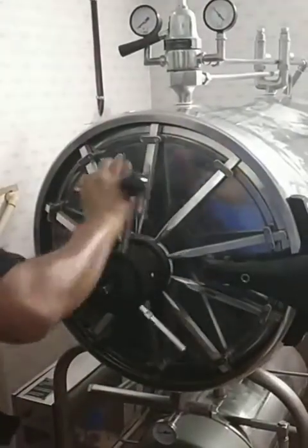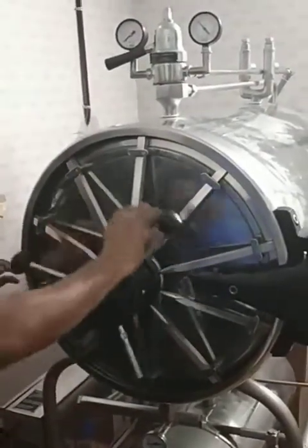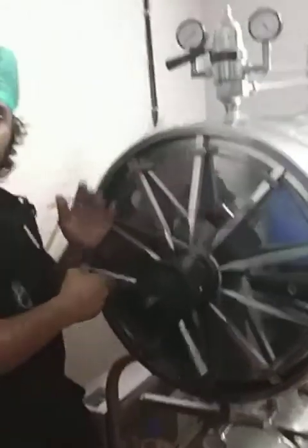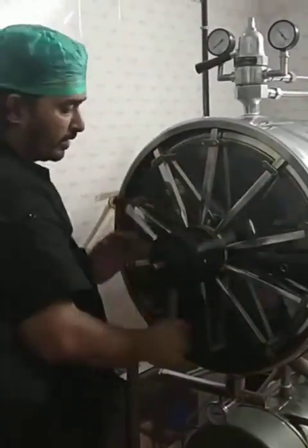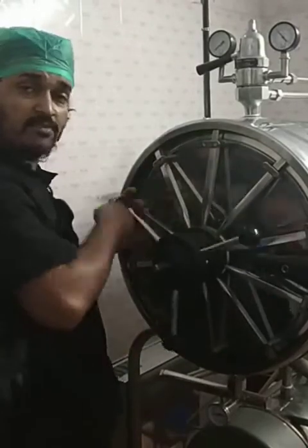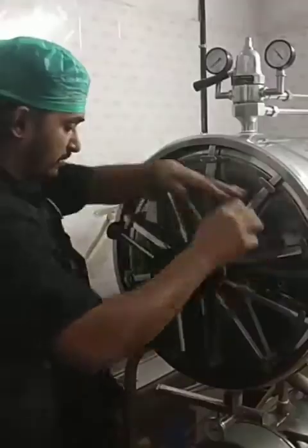The important thing to understand is the temperature-pressure-time combination, which remains the same for the autoclave: 121 degrees centigrade temperature, pressure is 15 to 20 psi, and time is 15 to 30 minutes. That remains a standard.